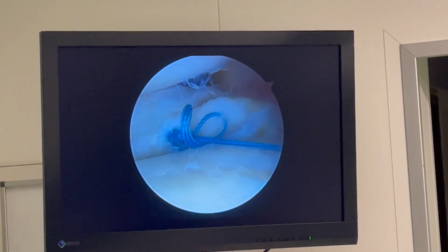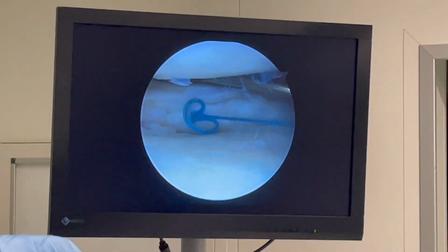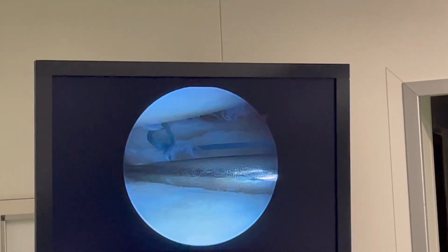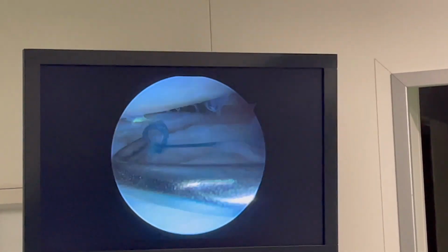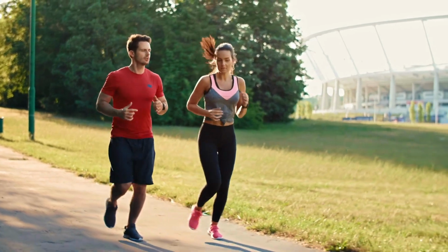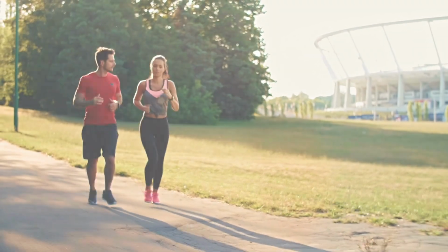Benefits. Meniscal repair with anchor sutures aims to preserve the natural meniscus, which helps maintain joint stability and function. Minimally invasive arthroscopic surgery results in smaller incisions, reduced pain, and faster recovery compared to open surgery. Successful meniscal repair can reduce the risk of long-term joint degeneration and osteoarthritis. It's important for patients to follow their surgeon's post-operative instructions carefully to optimize the outcome of meniscal tear repair with anchor sutures. Successful repair can lead to improved knee function and a return to an active lifestyle.